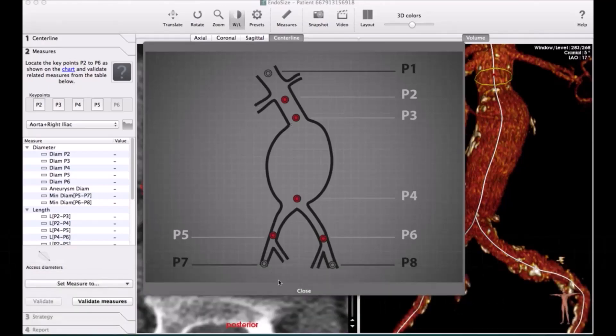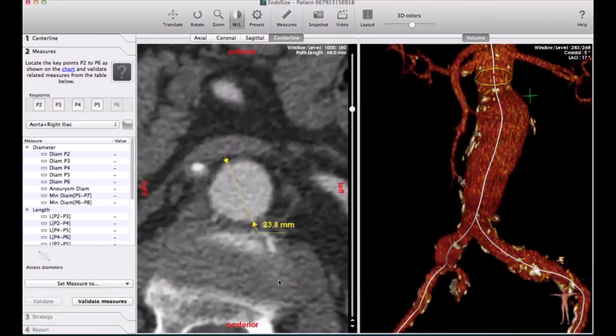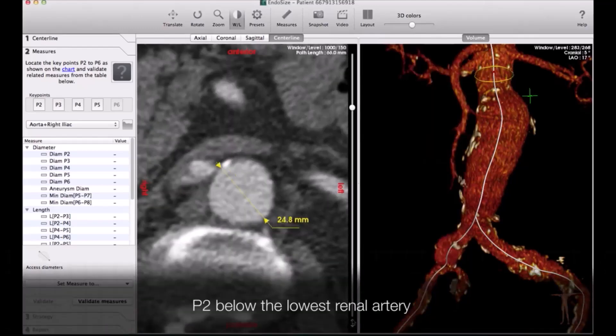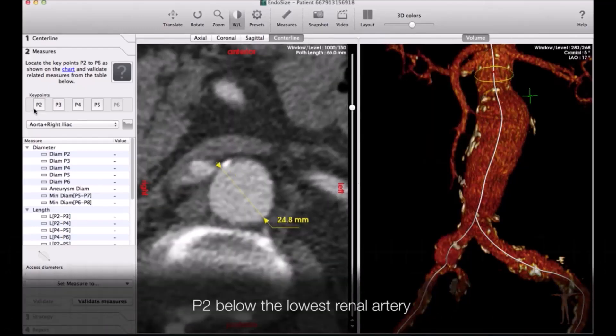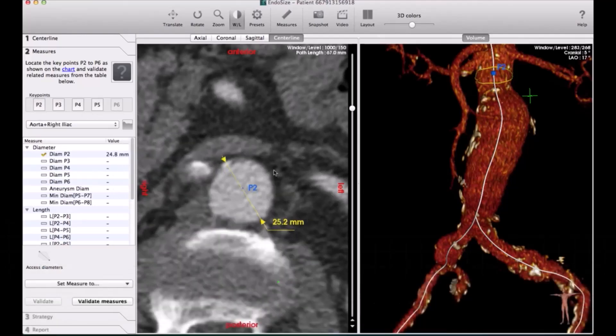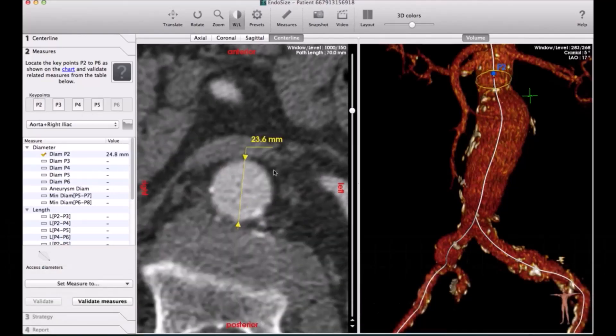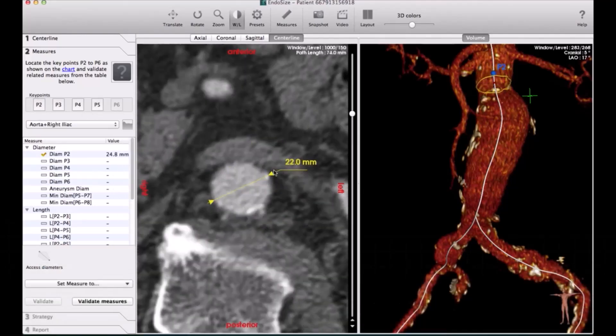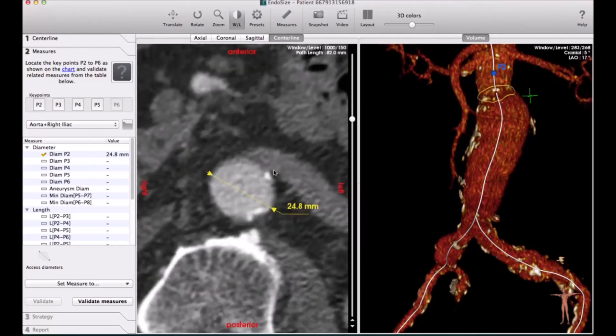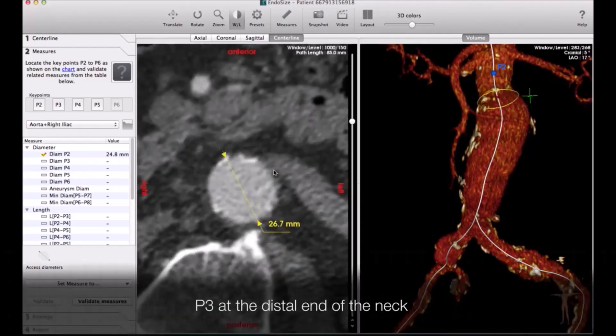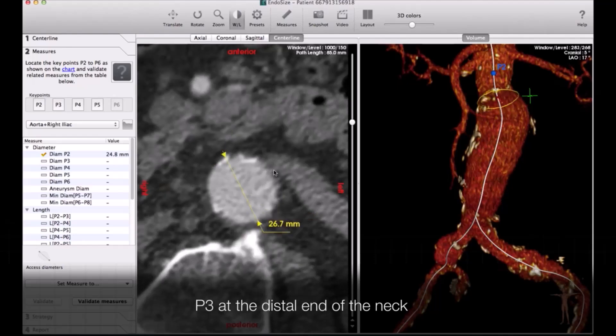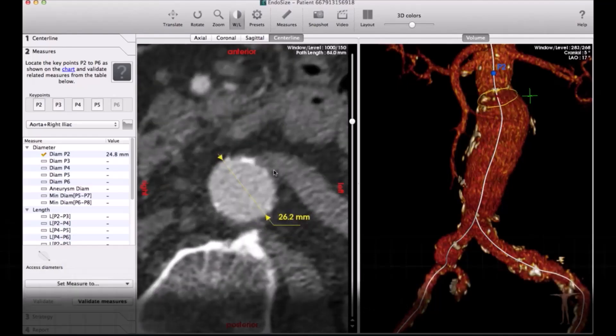So you do the P2, P3 at the neck, the lowest part of the aortic neck, the sealing zone. Then after that is the aneurysm, and then after that is the lower part of the aneurysm. All this is done automatically for you with the machine.